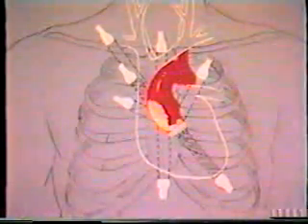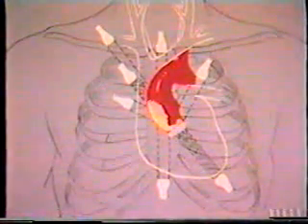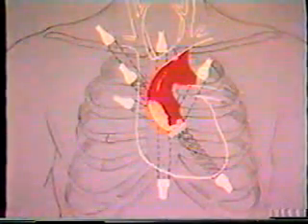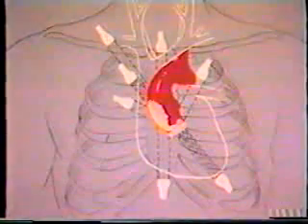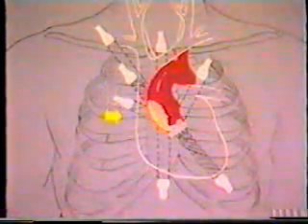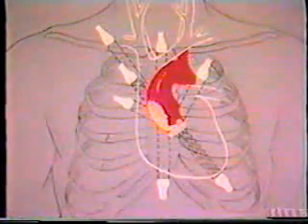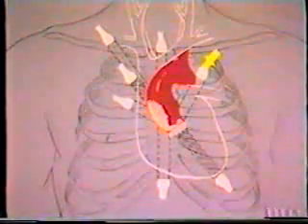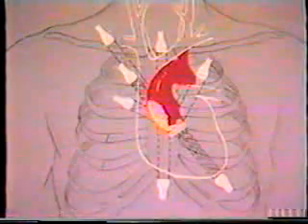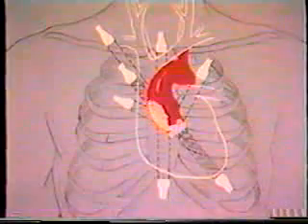As with stenosis of the native aortic valve, it is important to utilize multiple transducer positions when establishing maximum instantaneous and mean pressure gradients across aortic prostheses. In addition to the apical position, right parasternal positions should be used. For completeness, the transducer should also be placed in suprasternal, left parasternal, and subcostal positions. In each position, fine manipulations of the transducer should be made until the maximum spectral envelope is obtained.